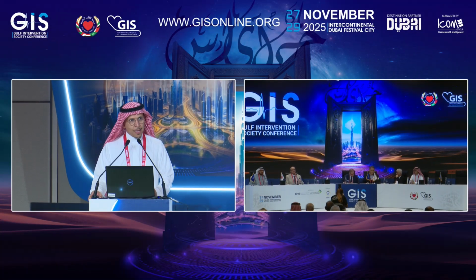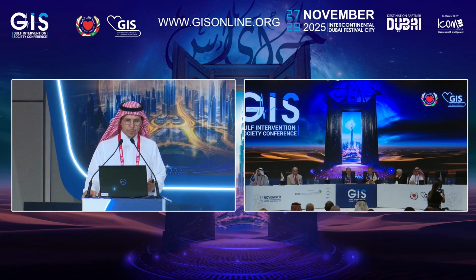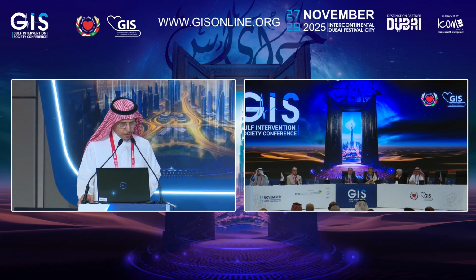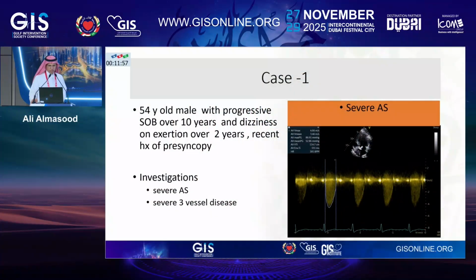Second, my task in the coming few minutes is to convince you that you can use DCB in CTO successfully. I'll just walk you through several cases and I hope it will be of educational value.